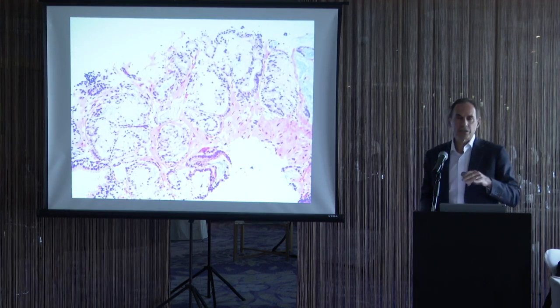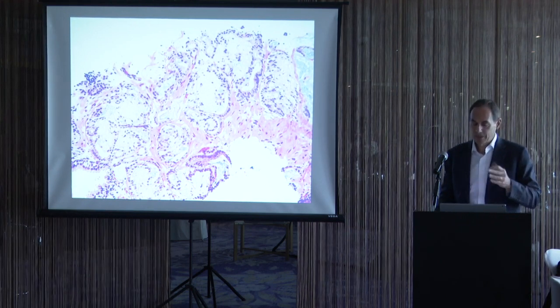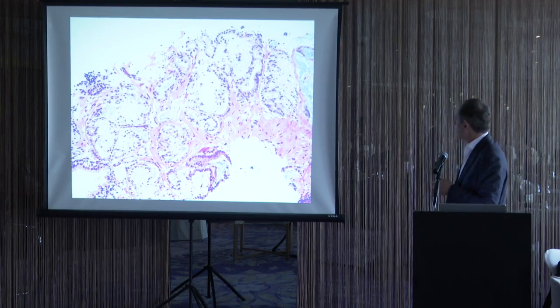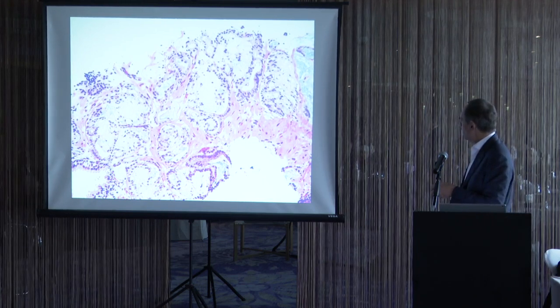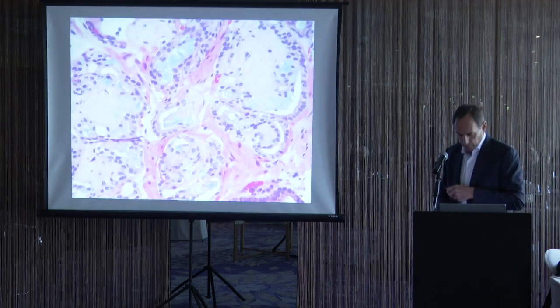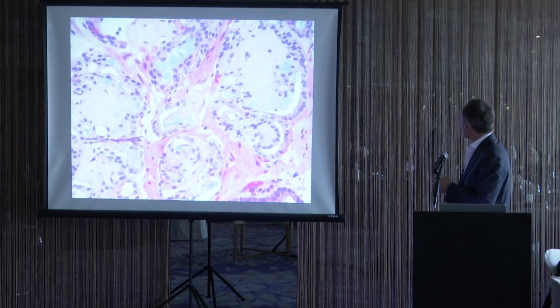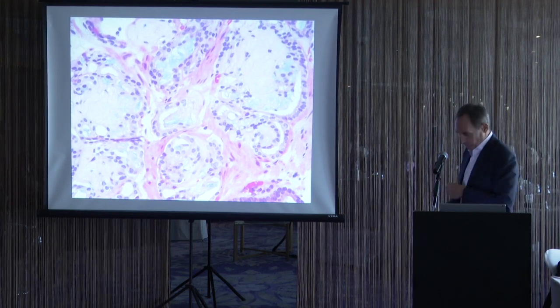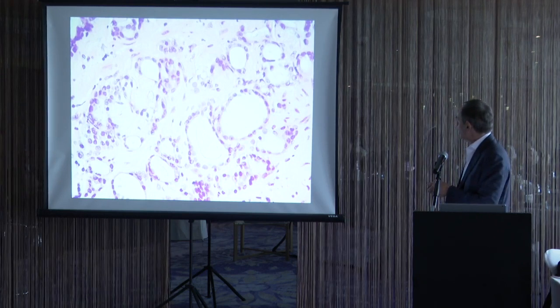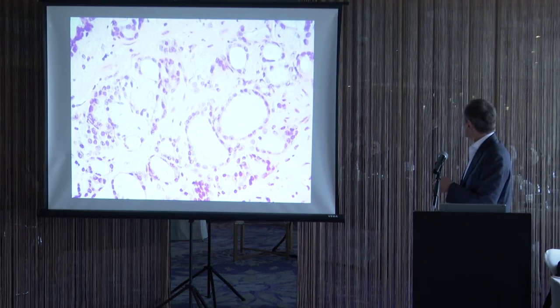Mucinous fibroplasia is also diagnostic of prostate cancer, even if there's nothing else that you're comfortable to make the diagnosis. The reason I call it mucinous fibroplasia is you often see that blue-tinged mucinous secretion, and then you start seeing this delicate collagen growing into that mucin. Here it becomes a little bit more organized, where you see the blue mucin and then these collagen bundles. And sometimes it becomes even more collagenized, where you get these fine, almost thread-like collagen little bundles.